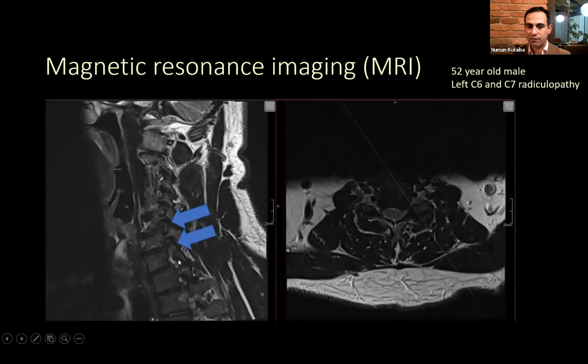And if you do an oblique reformat or an oblique acquisition that is commonly performed nowadays in public and private settings for inpatients and outpatients, you see that the foramina at these levels, similar to the oblique X-ray I showed, are filled with disc material. And unlike this foramen here, where the nerve exits with a bit of CSF around it, the nerves on this level are compressed. And this patient proceeded to have nerve root injections to both levels.